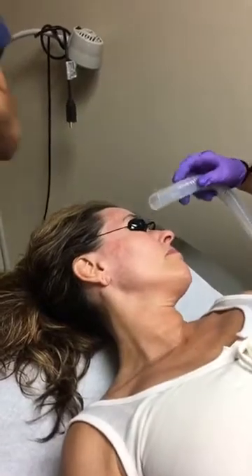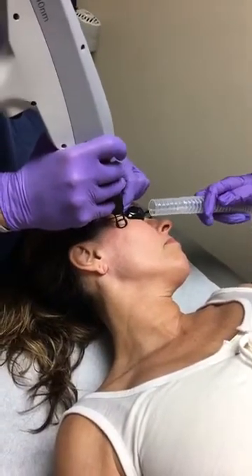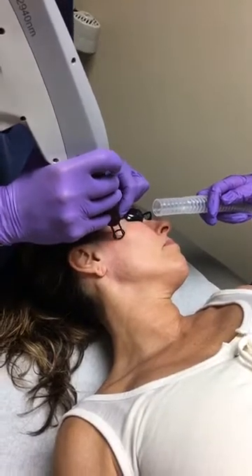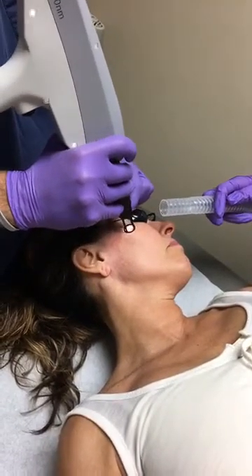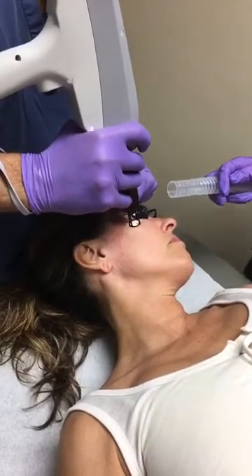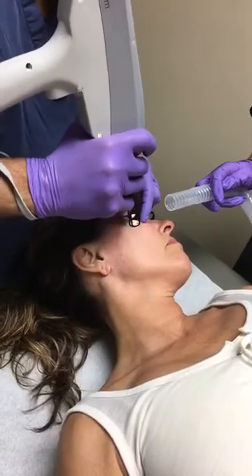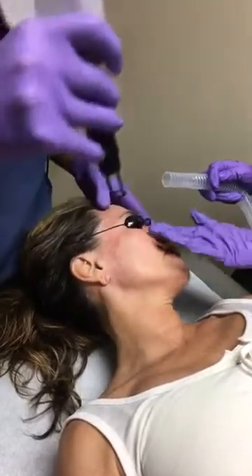I am going to turn the intensity up a little bit here and move a little bit faster. I am going to go back over this area here.